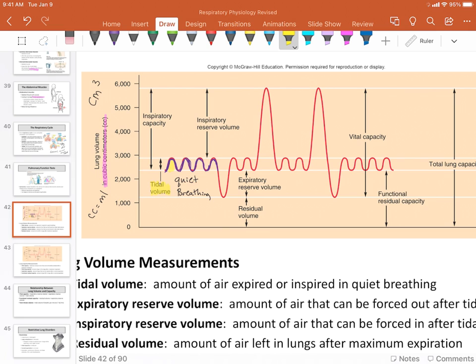In a functional test, you would be asked to breathe quietly for a given length of time, perhaps a minute, perhaps five breaths. In lab we do five breaths. Here we only see four complete respiratory cycles. In this graph, the individual doing this test would then have been asked to breathe out, to expel as much air as possible, to force every ounce of air out of their lungs that they could. They would do this by contracting the internal intercostals as well as really strongly contracting the abdominal muscles to force that air out. In so doing, they would expel a specific volume of air in addition to the 500 milliliters. So they would expel the 500 milliliters - let me color that in yellow, here's my 500 milliliters, that is my tidal volume. And then on top of that, the area shown in pink would be the milliliters that are expelled by recruiting muscles that are used in forced or active breathing.